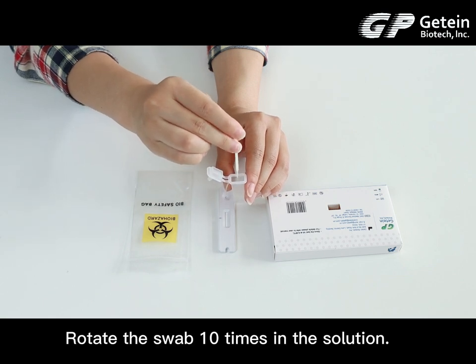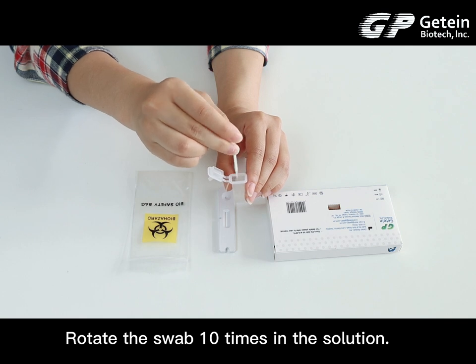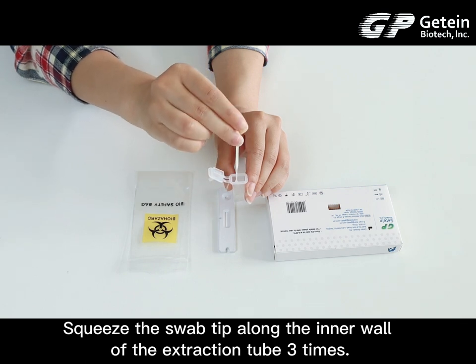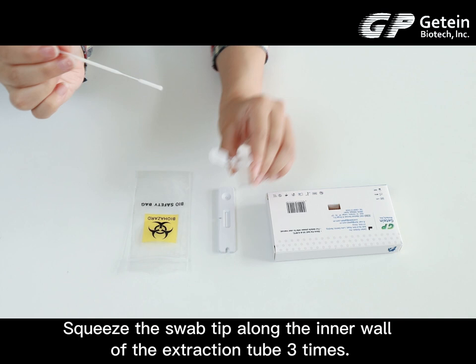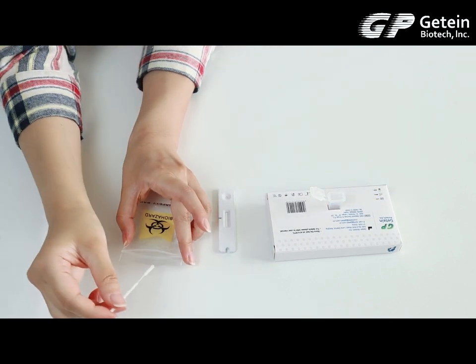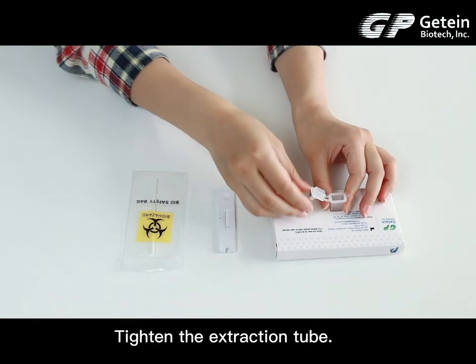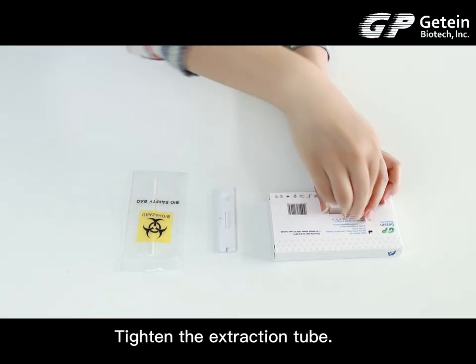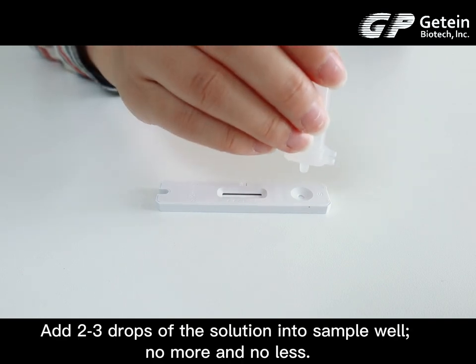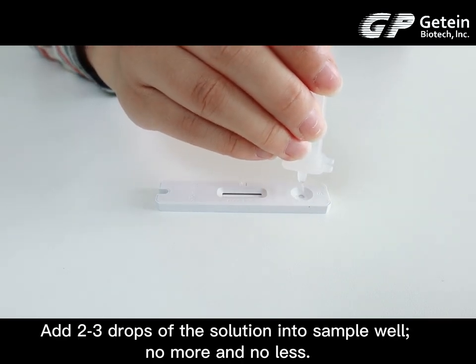Rotate the swab 10 times in the solution. Squeeze the swab tip along the inner wall of the extraction tube 3 times. Tighten the extraction tube. Add 2 or 3 drops of the solution into the sample well.